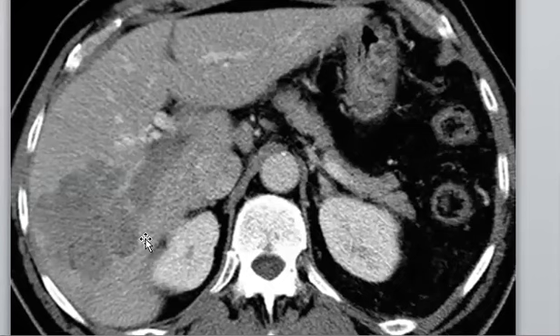Okay, so when you find liver cirrhosis, then, nice, Marwa, you will search for the vascular affection. What is the most important to mention? The portal vein. Yes, so mention that the portal vein is affected in this case. Don't forget.